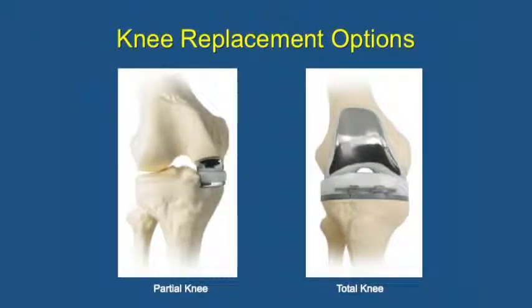Here, it doesn't matter what the cartilage looks like, because remember that capping cartilage I talked about? I'm cutting off a thickness of capping cartilage that's 9 millimeters thick, effectively, and guess how thick that implant is? 9 millimeters. I'm putting a new cap on. Make sense? I'm cutting off a certain amount of bone here, and I'm replacing that bone with this. This is a metal tray, and that's a piece of high-end plastic that snaps in, called polyethylene, same as in your hip. This clips it in. The metal tray and the metal capping part on the thigh bone are cemented in place.